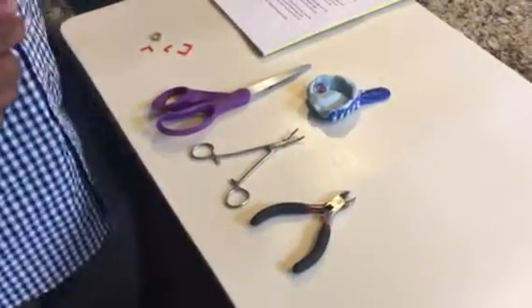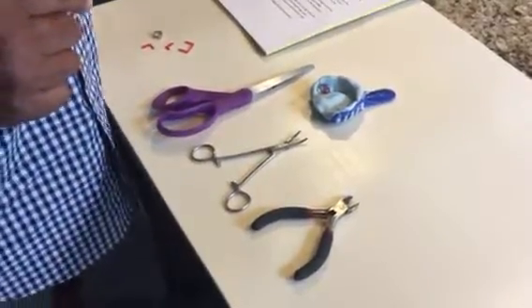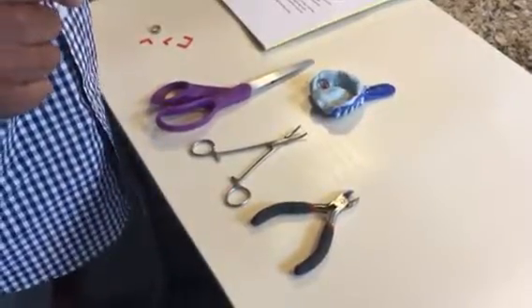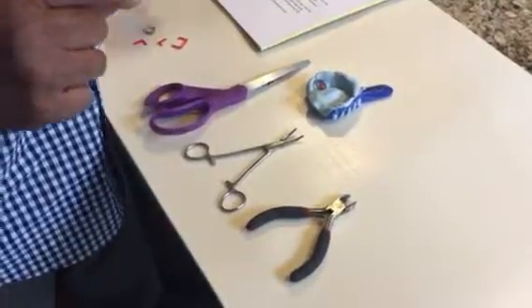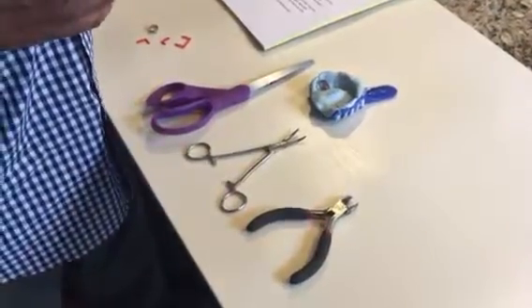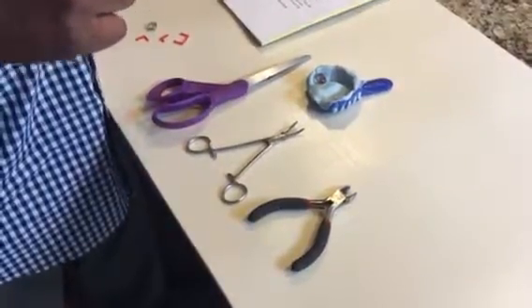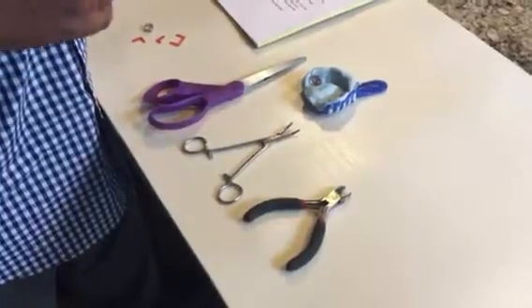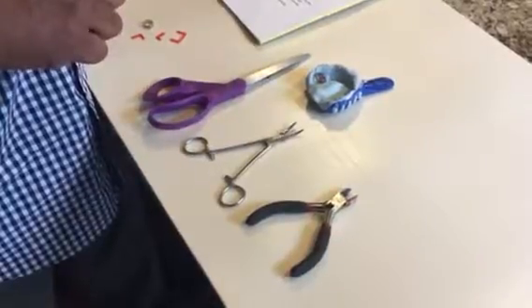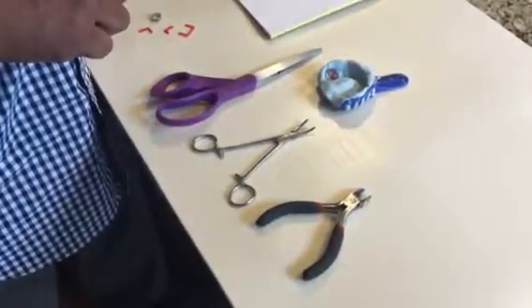For you folks that have been in the dental assisting field or the dental laboratory field for years, you have always come across this problem: movement of the stainless steel band inside the alginate impression. There are folks who have had experience with this, and they sought to remedy this by putting super glue inside the impression and locking the band into place with super glue. Some folks crisscross 0.018 or 020 wire across the gingival top of the stainless steel bands to lock them into place.